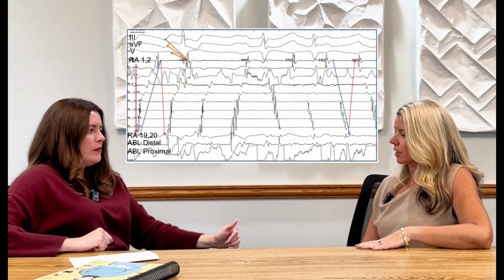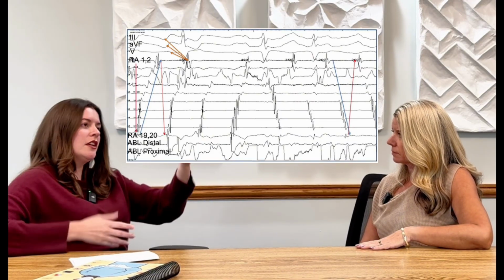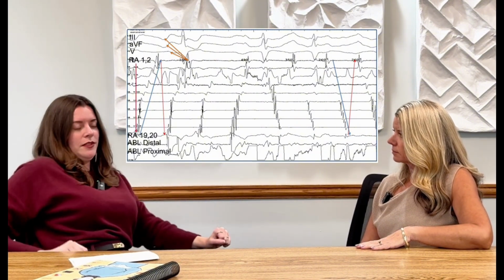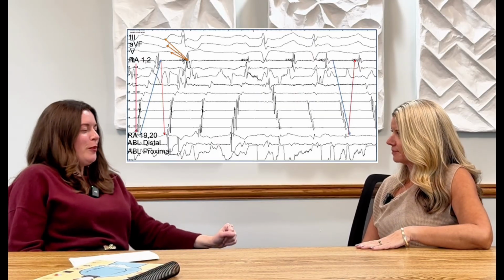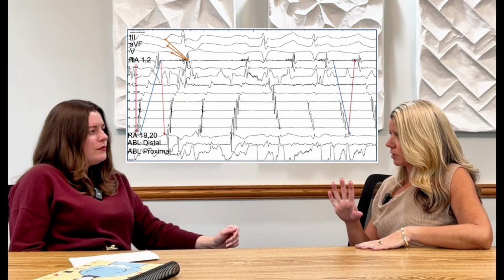Yeah, you need to be looking at the whole picture. I have noticed there's change in conduction. There is kind of a global change more than a pinpointed change, at least for the ones that I've looked at. I haven't looked at VTs or any of that yet. That sounds more pinpoint, but you have to look at the whole picture. When you're doing pacing protocols, you're specifically looking for that one thing. But when you're in real time, you're looking at all of it.